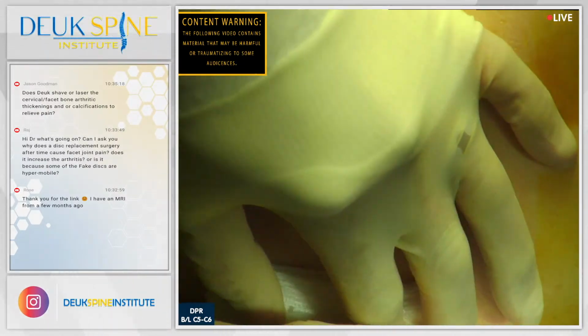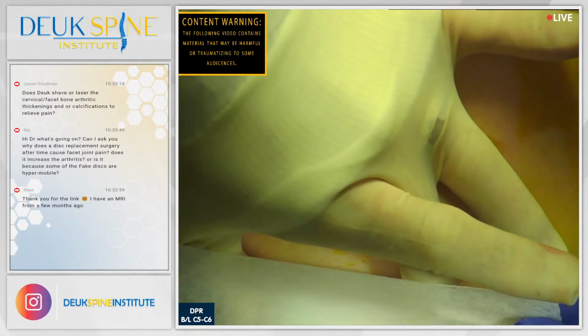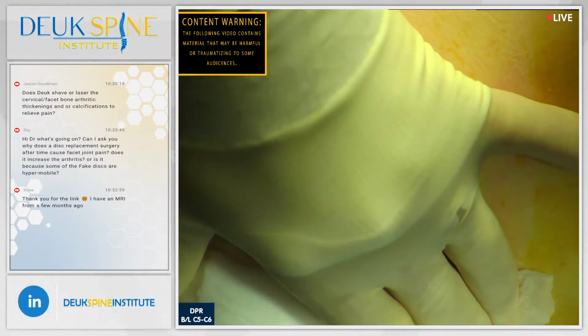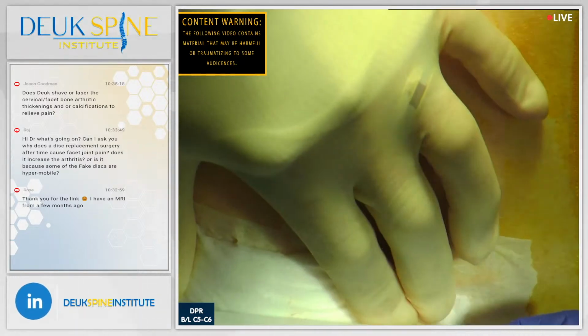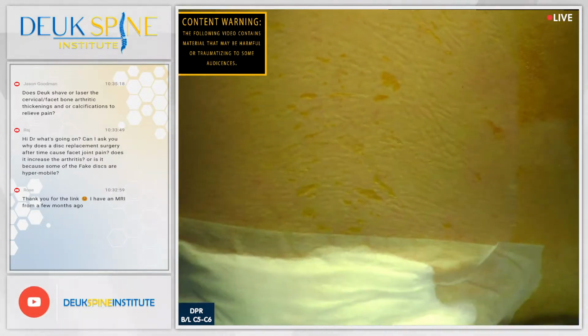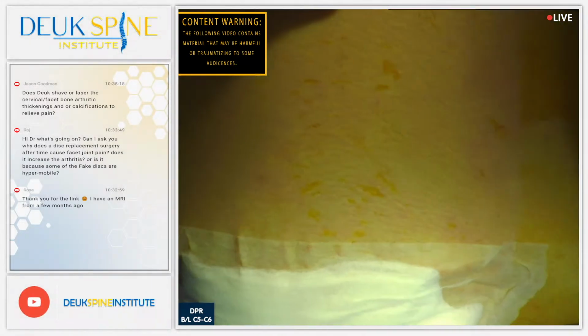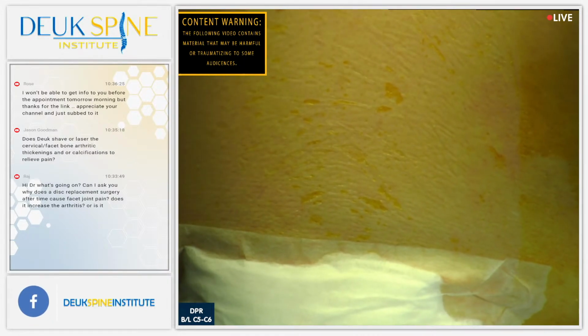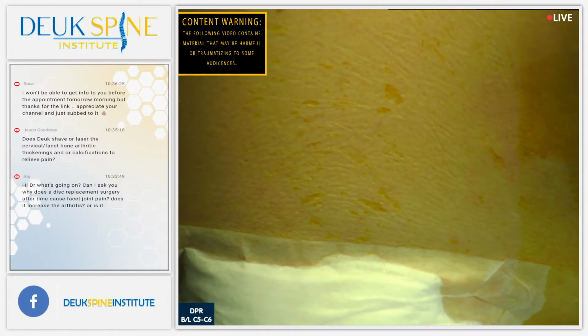And then one more question coming from Jason on YouTube, asking, does Dr. Deuk shave or laser the cervical/facet bone arthritic thickenings and or calcifications to relieve the pain? No, we don't need to shave any calcifications. We don't need to shave facet arthritis. All you need to do is destroy the pain nerve to the joint. It's called the medial branch of the dorsal ramus.